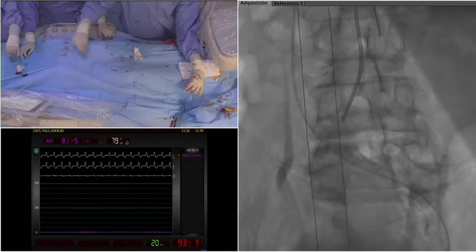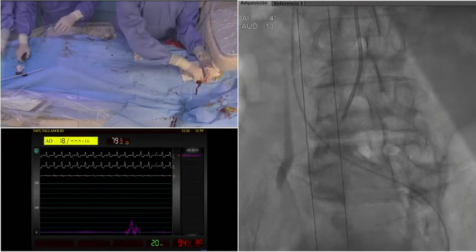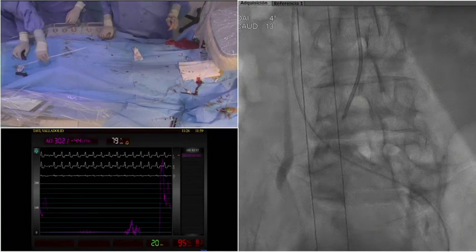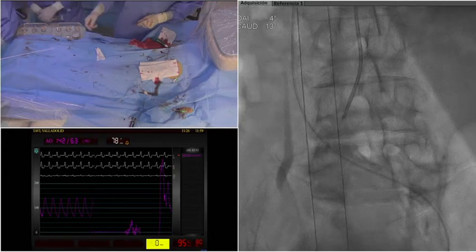Okay, then now for closing, we are going to advance the small dilator of the Python introducer to make the closure progressive.